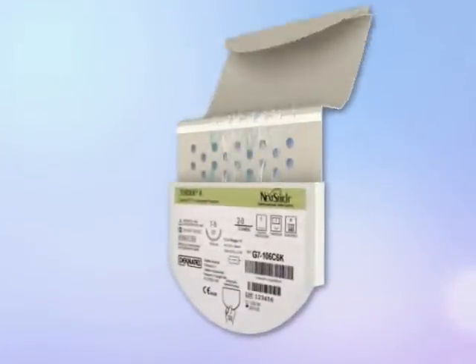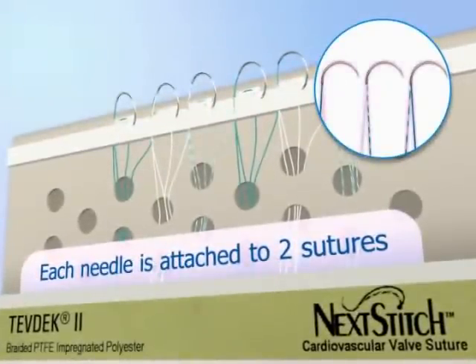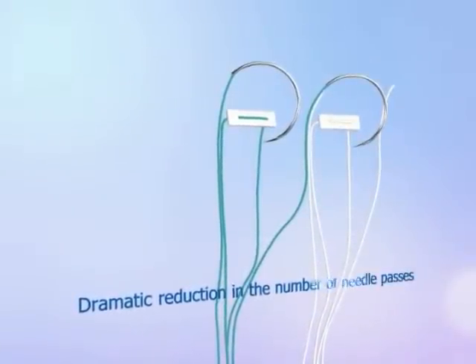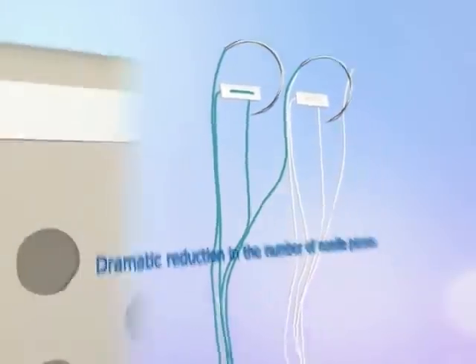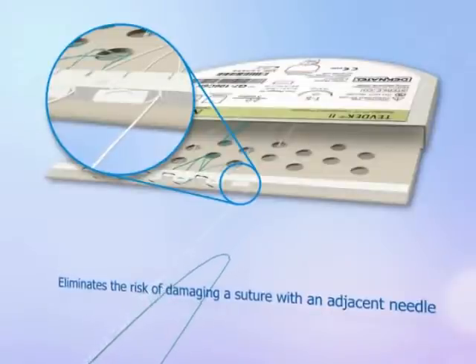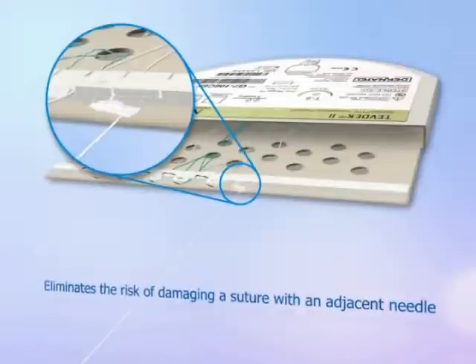Next Stitch is a continuous chain of linked horizontal mattress sutures where each needle is attached to two sutures. This design allows for a dramatic reduction in the number of needle passes, creating fewer needle punctures to the annulus. This enables exact approximation of adjacent sutures by placing two sutures with a single needle pass, eliminating the risk of damaging a suture with an adjacent needle.